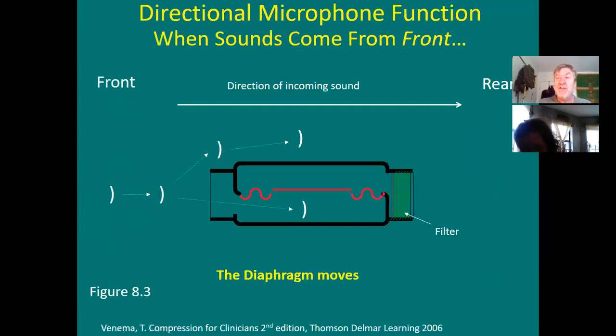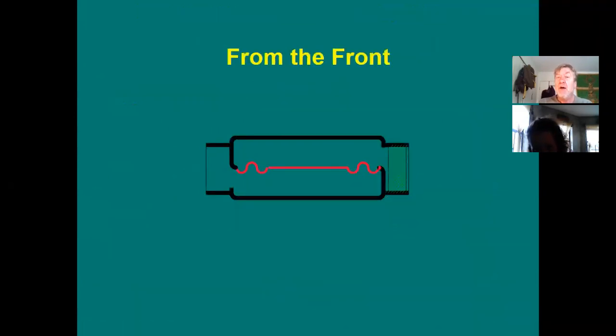Look at the little white lines here. Sound is coming in the front door, and it wiggles the diaphragm. The rest of the sound moves on. Cool. Now, let's watch it in animation.